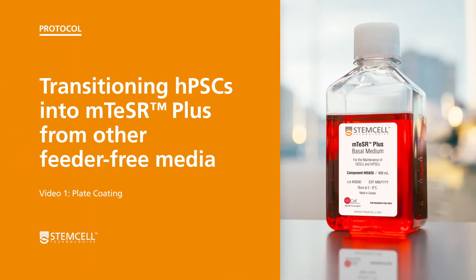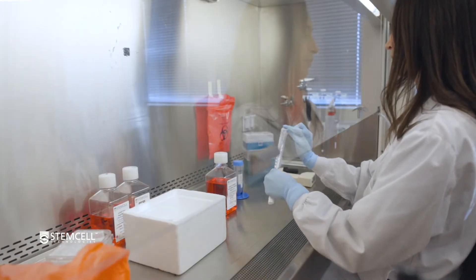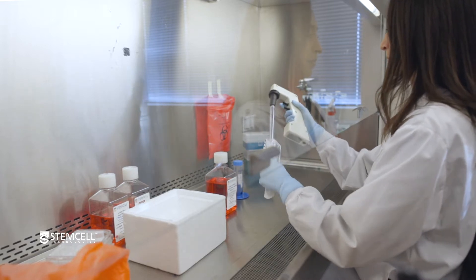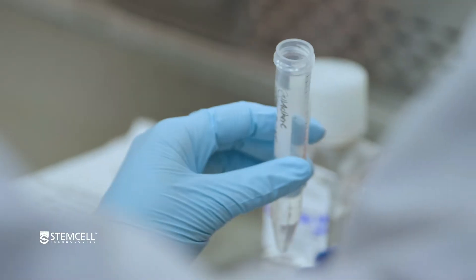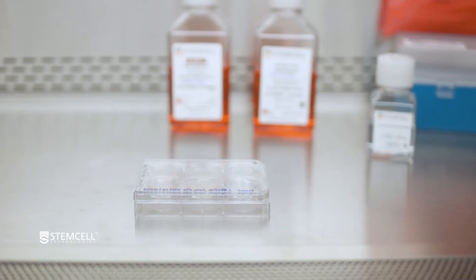Here we will describe how to coat a 6-well tissue culture treated plate with Corning HESC qualified Matrigel, or a non-tissue culture treated plate with Vitronectin XF. While we don't show it here, mTeSR Plus is also compatible with Laminin 521 coated plates when coating according to the instructions in the product information sheet.